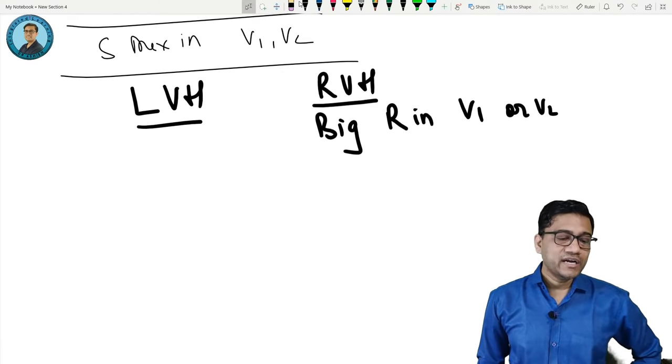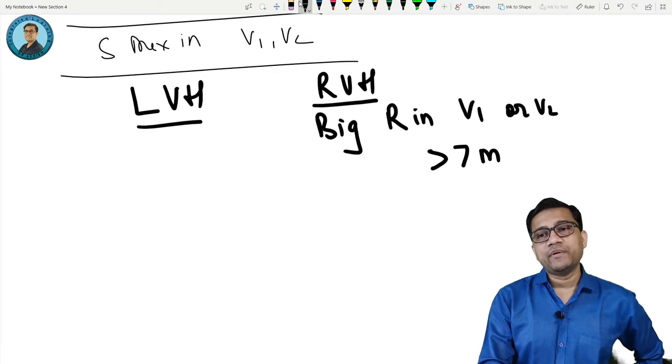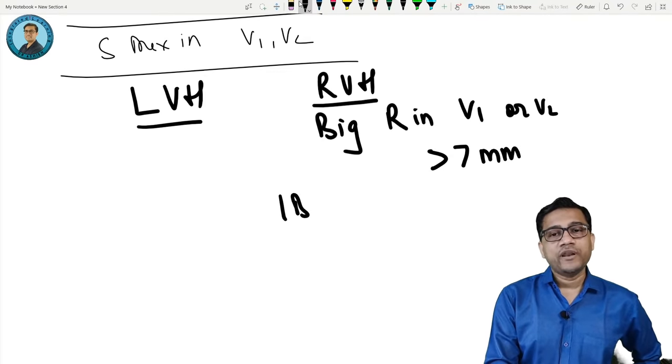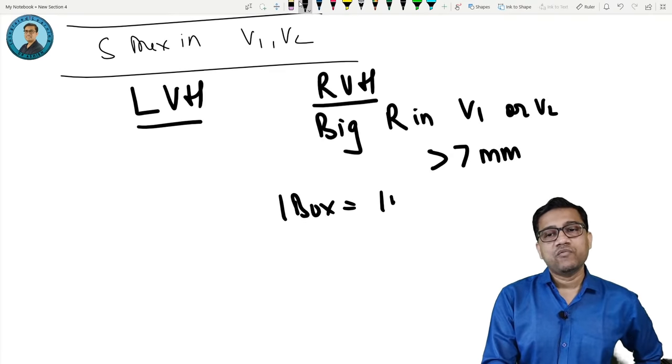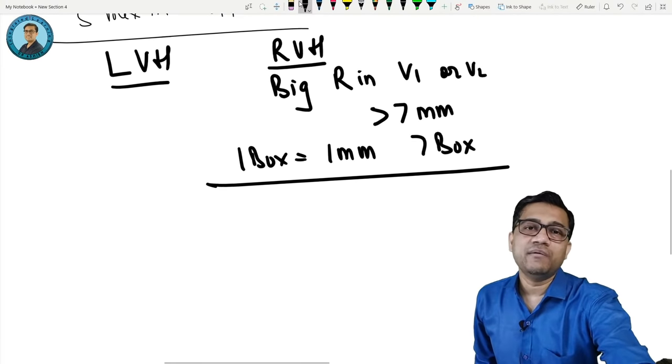Okay, so the criterion is this. How much? More than 7 mm, that is 7 boxes. So remember, 1 box is 1 mm. So how many boxes? 7 boxes. Are you clear? So that is the main criterion.